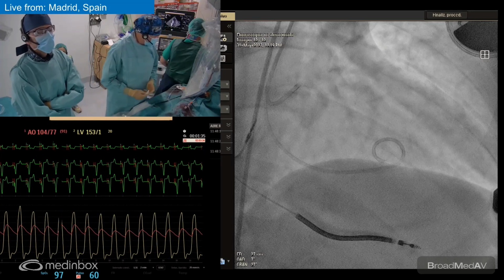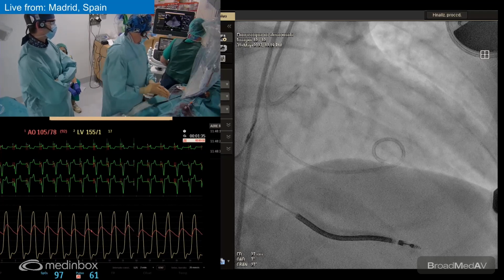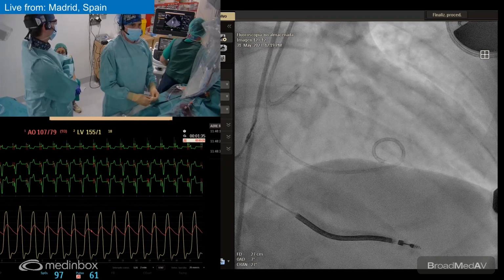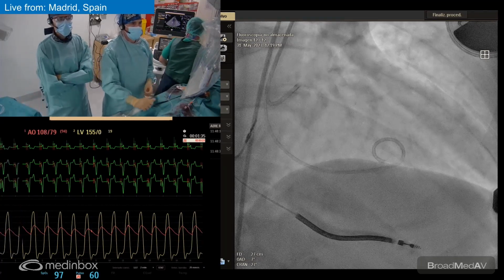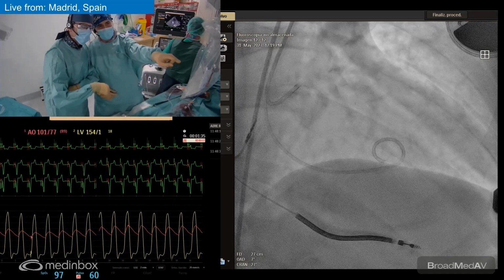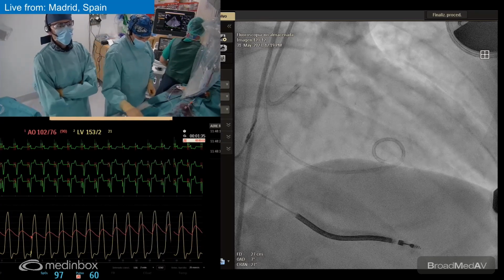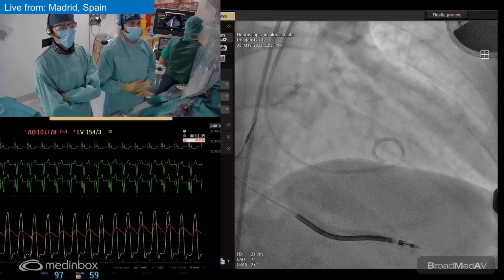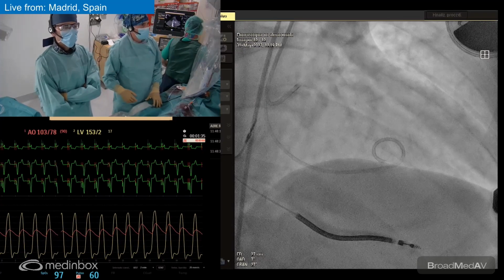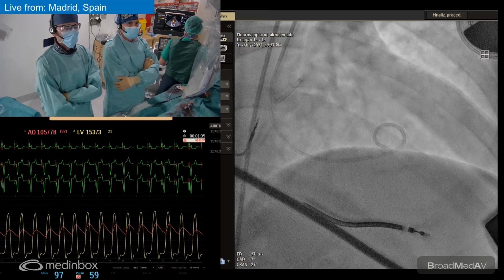of septal thickness. Okay. For the echo team, are there any specific criteria you use during the echocardiography guided procedure to ensure optimal outcomes? Well, I think in this procedure, the main objective of echocardiographic guidance is to ensure safety. So the main thing is not to inject alcohol in a septal that irrigates a structure that we don't want to infarct, for example, a papillary muscle or part of the right ventricle.